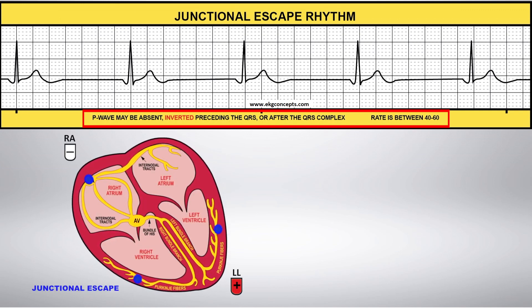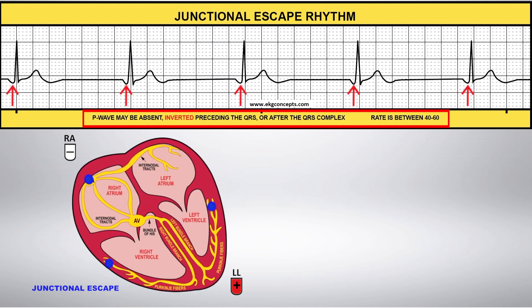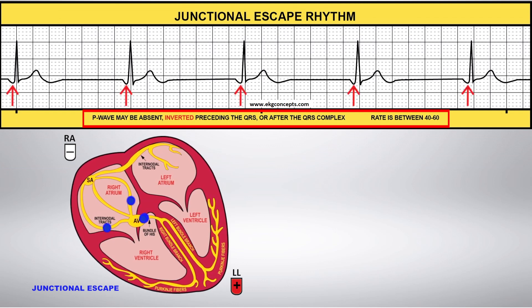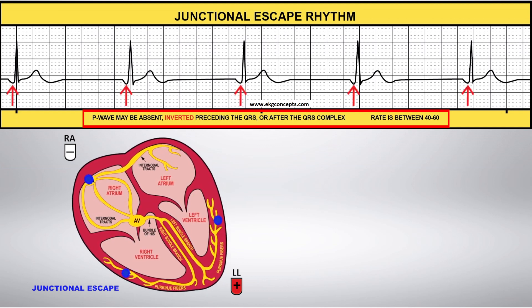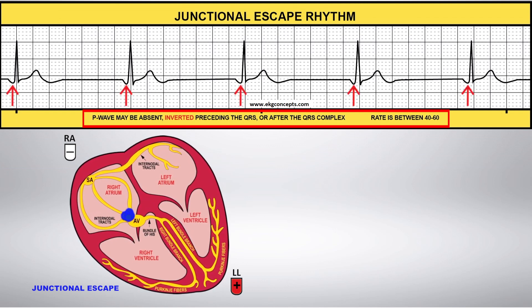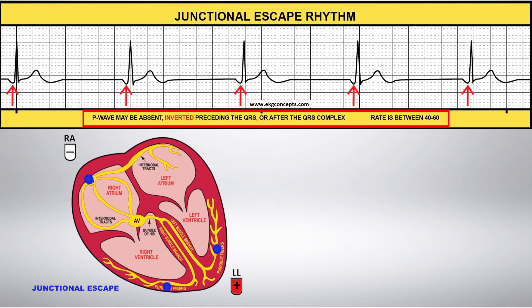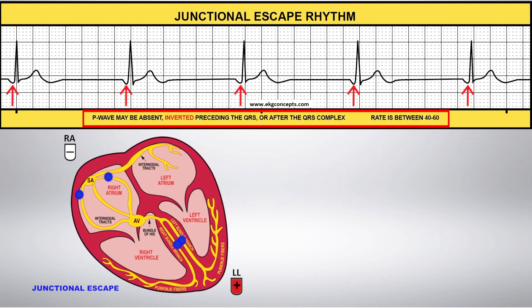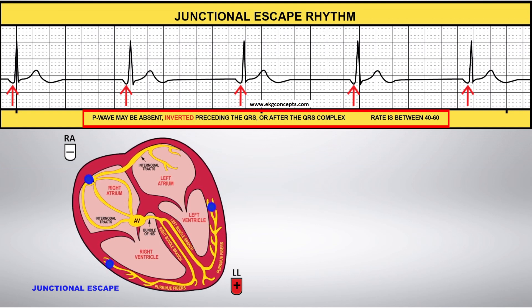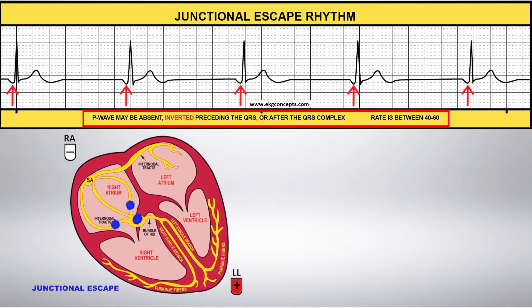Since the impulse originates from the AV node, it travels backward toward the atria and toward the negative lead, which causes the P wave to be inverted, as illustrated by the red arrows.